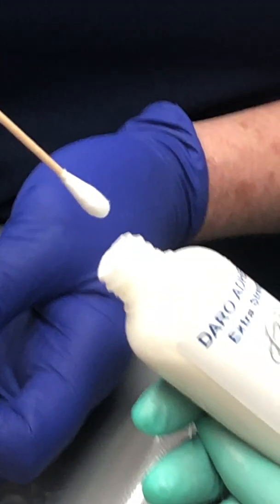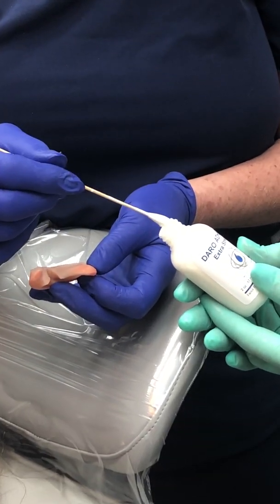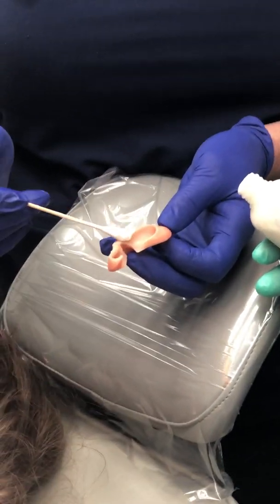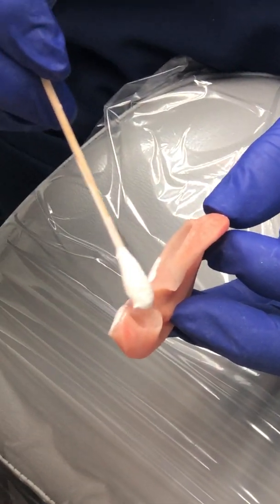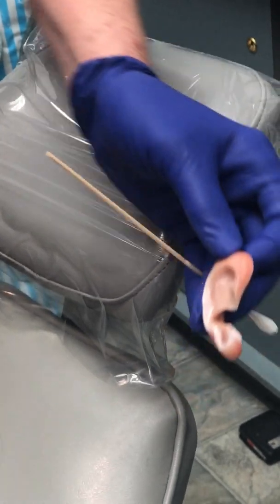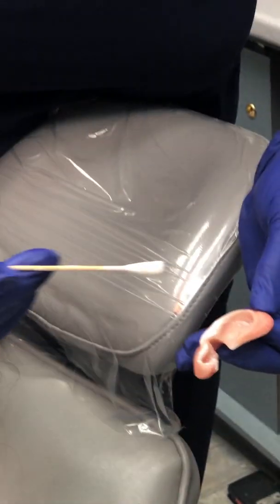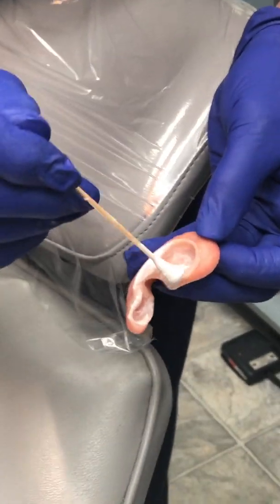Here we have medical grade adhesive, hypoallergenic, and it comes out of the bottle white. The entire edge of the prosthesis is covered in adhesive, along with the inside, so we have a nice retentive area. Make sure the inside is good and dry, and apply the adhesive so you have a nice white layer.